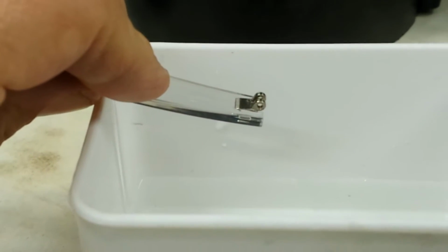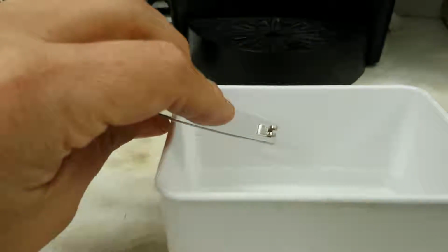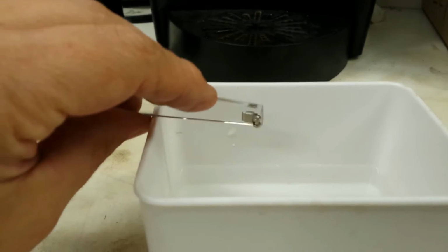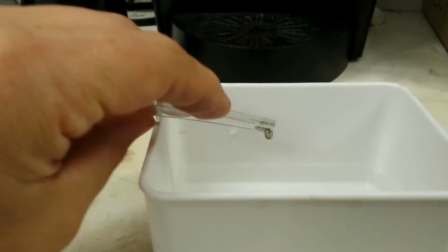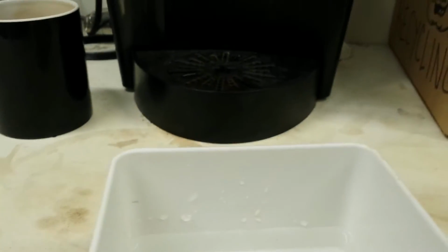Let's just say that for some strange reason you decide that you need to get the hinges out of a pair of glasses. Here's a method that I've kind of stumbled across that seems to work pretty well. I got my little tray of water here, and this is going to be tricky to do with one hand, but I'm going to try it.